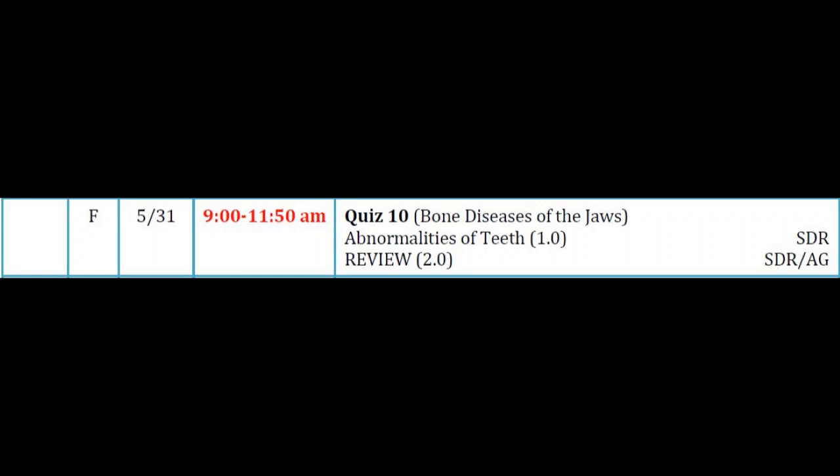Oh, the fibrous dysplasia case. The ground glass bone. It was a ground glass bone. So you are hanging your answer on a location, whereas that's on down the line. So your answer first and foremost has to match the radiographic appearance of the lesion. So that's why I always ask you first, is it radiolucent, opaque, mixed, or ground glass? Because that is the most important thing to match.